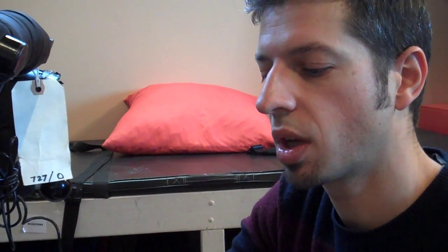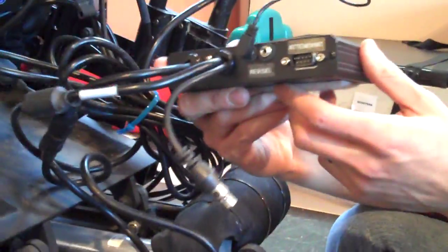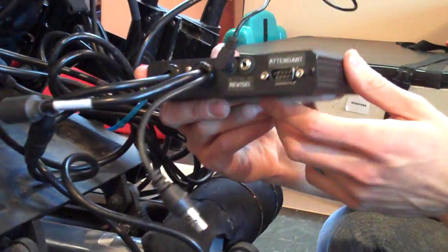If you want to interface to the power chair but not use a head array specifically, you could use other switches and plug them in. You would need an adapter. What this really serves as is an interface so that you can drive with alternative access, so you're not using just a joystick. This is your portal into that ability.